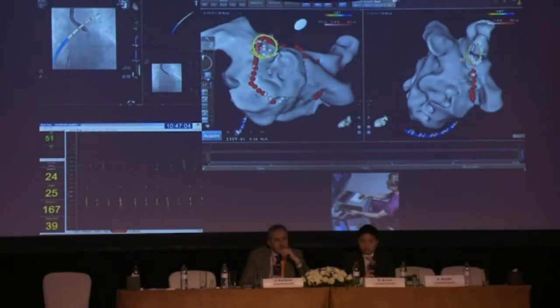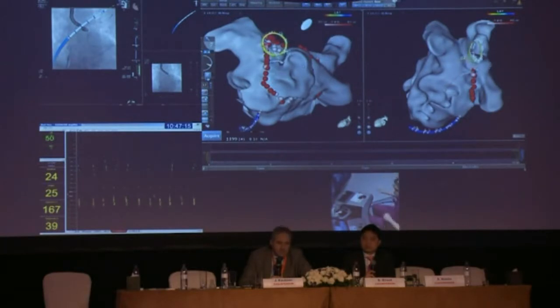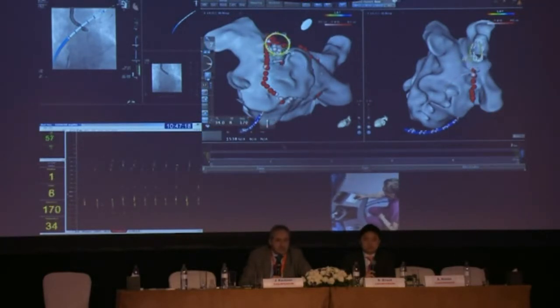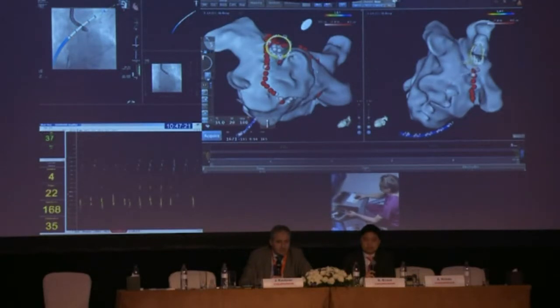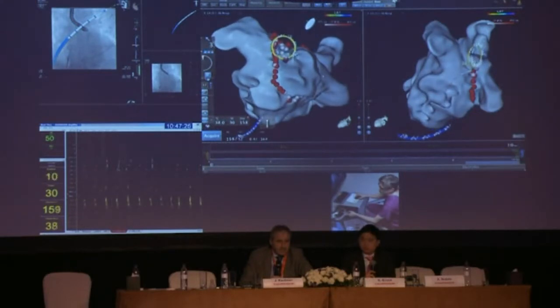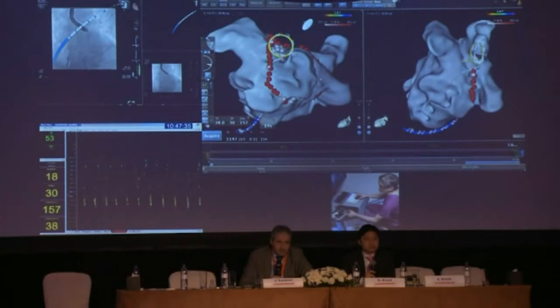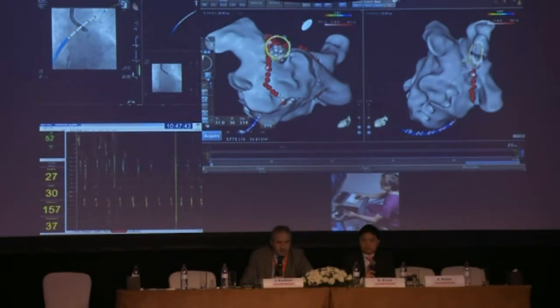If you did not have Smart Touch, then when we lost Smart Touch for a while because of the loss of the catheter manufacturing, we found that what we learned from Smart Touch actually meant that we weren't as comfortable without it, but we could do pretty well without it. We've also got the IntelliSense feature, which I don't think is as good as Smart Touch, but the Hansen force sensing does give you some feedback as to where you're sitting and the force you're applying. But the force isn't the only story. So for example, here you can see I'm on the venous side.